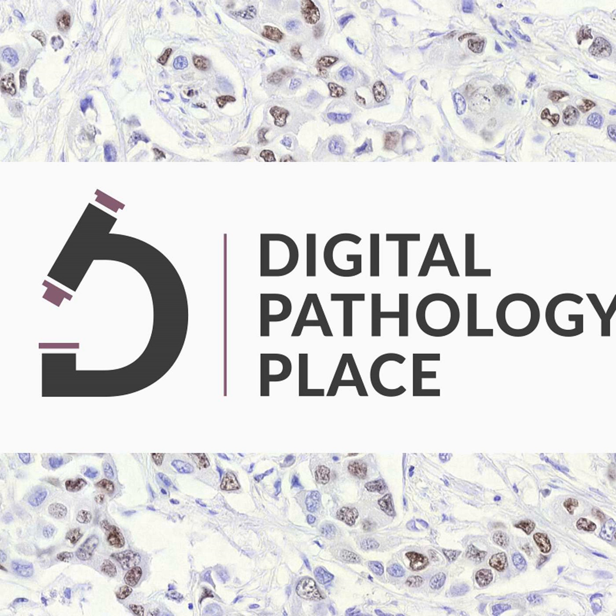The other thing to keep in mind, speaking of slides, is that when you're scanning slides, you want slides that are clean and dry. They've been dried for 12 to 24 hours. Labels not hanging off, cover slips not hanging off. All of those can be problematic for robotic machines for loading and unloading. So we're looking for good, clean, quality slides.